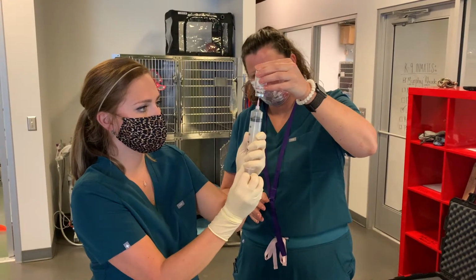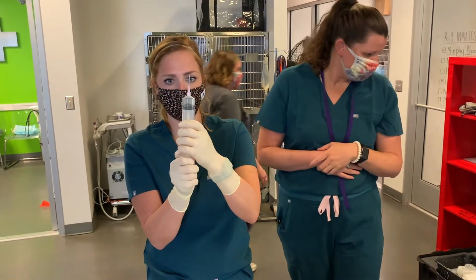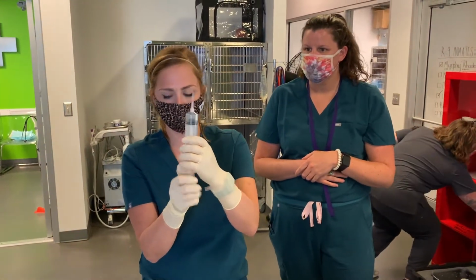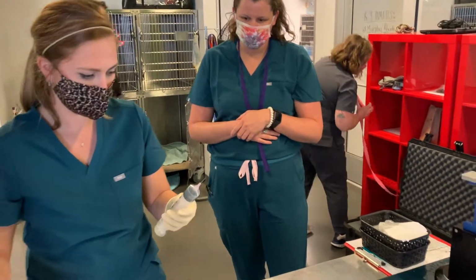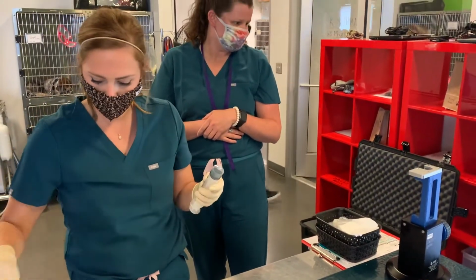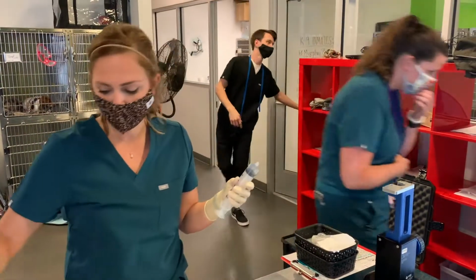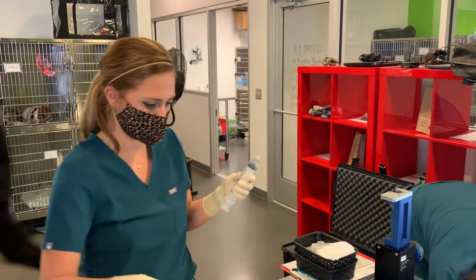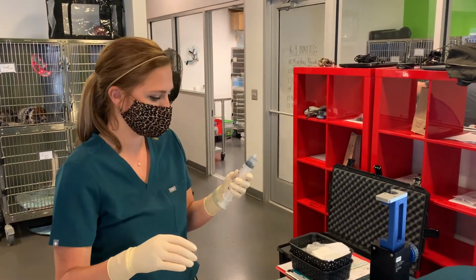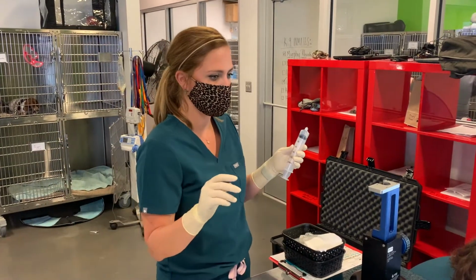So you should do the blood draw sterilely. So I'm pulling up the anticoagulant. So Nala's like 70 pounds. So we're gonna do 51 mils of blood and 9 mils of anticoagulant. Yeah, so 60 mils total with the anticoag in it.